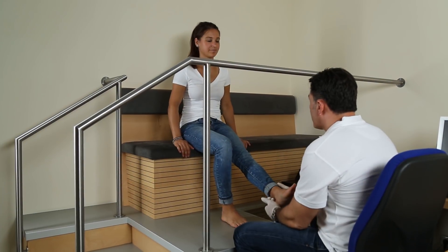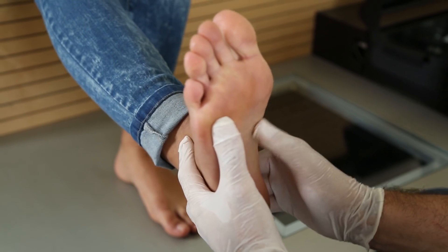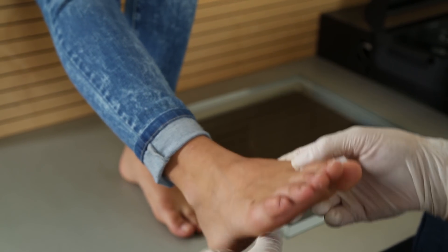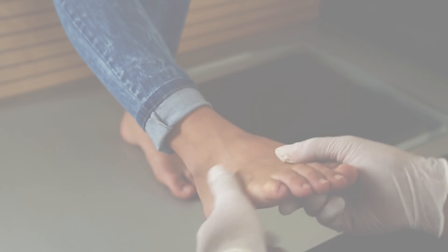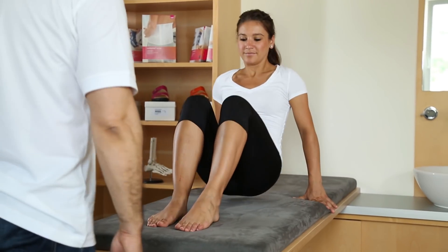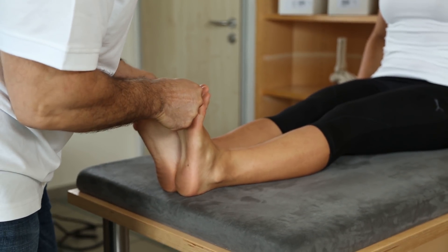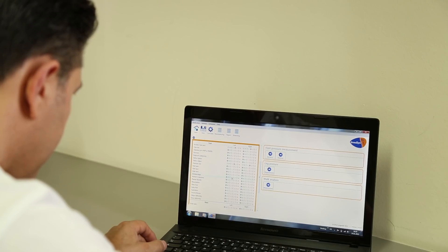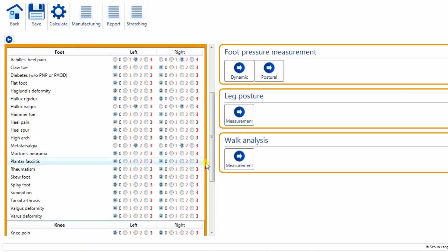Next step, the patient's feet are tested for mobility and sensitive areas. Afterwards, muscle tests of foot and leg muscles are performed. The results of palpation and muscle tests are then fed into the software.